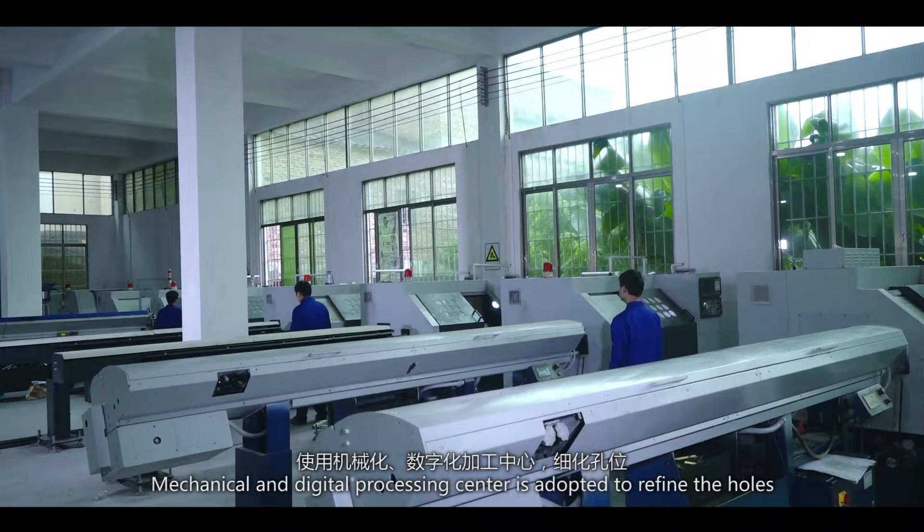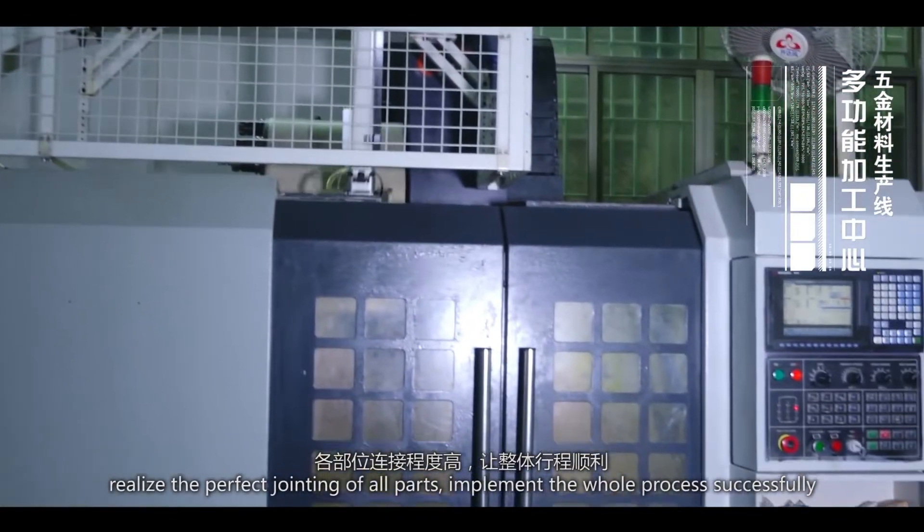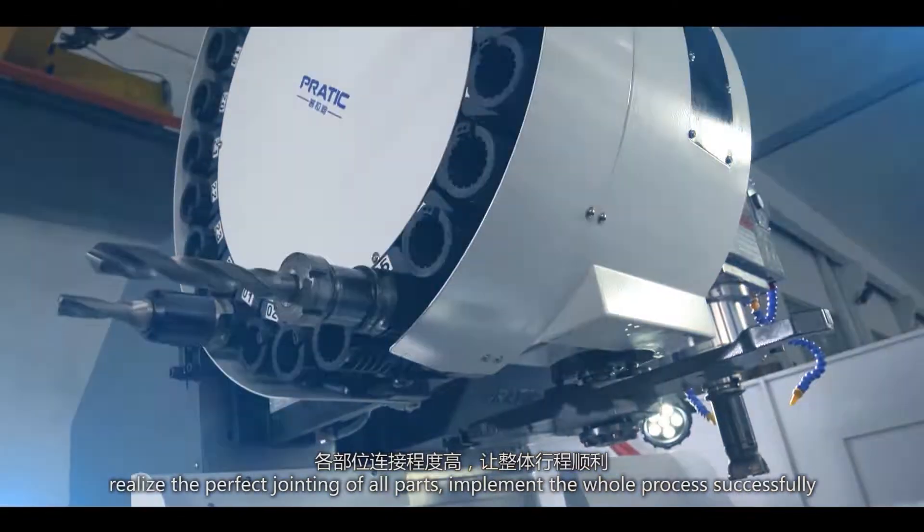The Mechanical and Digital Processing Center is adopted to refine the holes, realize the perfect jointing of all parts, implement the whole process successfully, and produce the firm and steady dental chair.